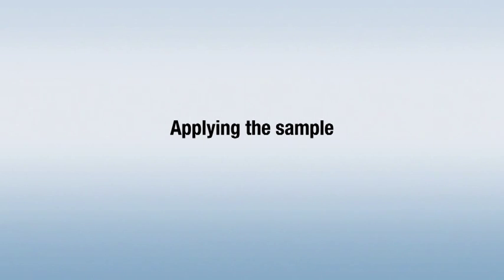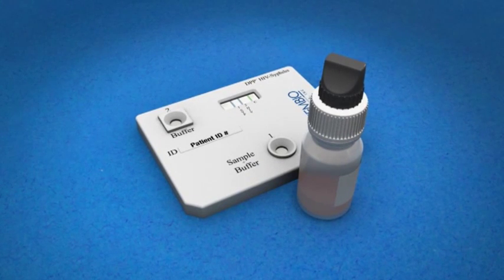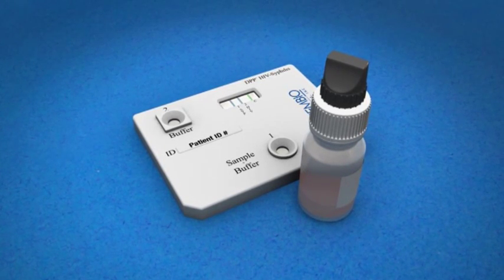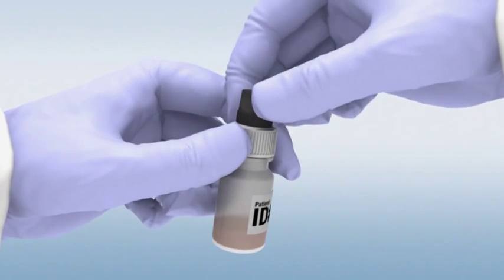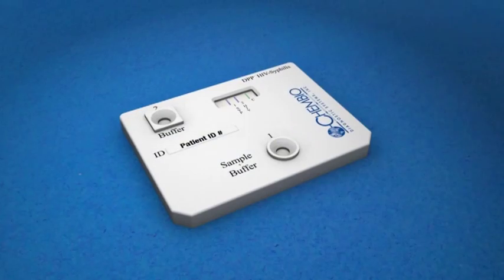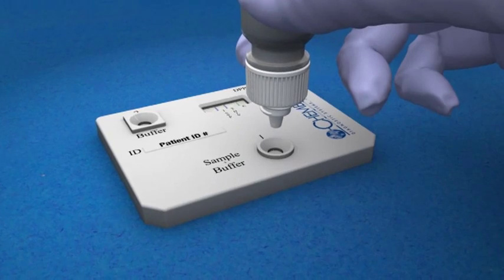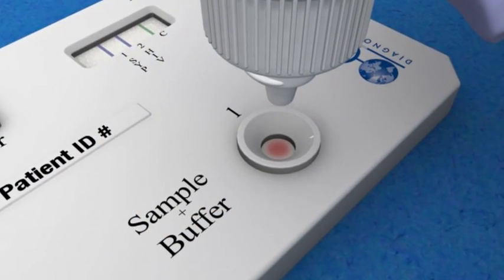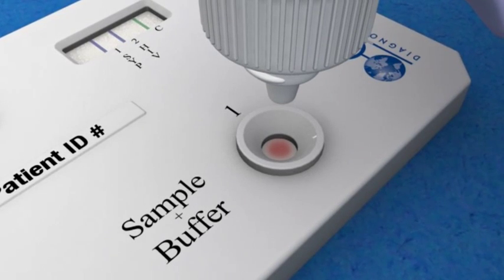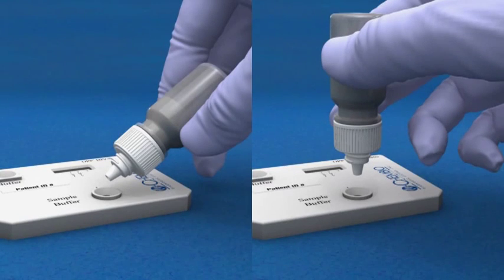Applying the sample. Before you apply the sample, make sure the DPP HIV syphilis test is placed on a flat surface. Unscrew the upper black cap, keeping the white cap screwed onto the sample tainer. Hold it in a vertical position but upside down, and gently squeeze two drops of the sample into the round sample well without touching the bottom of the well with the tip. Be aware that holding the bottle sideways will produce invalid results.